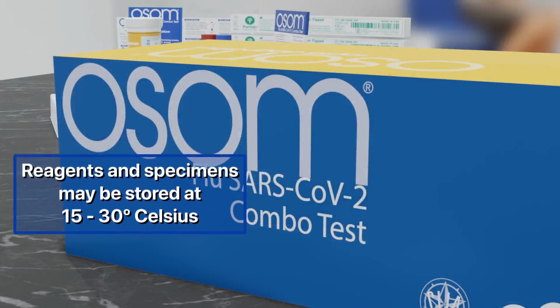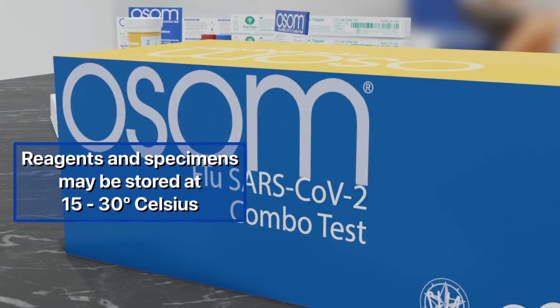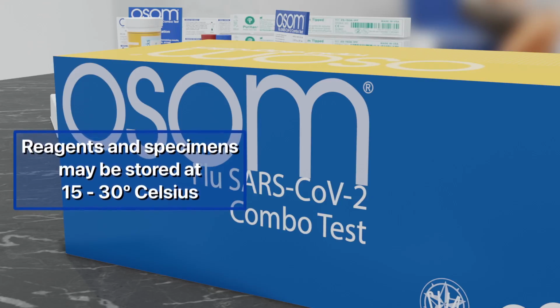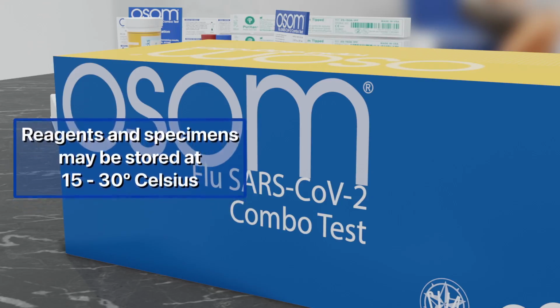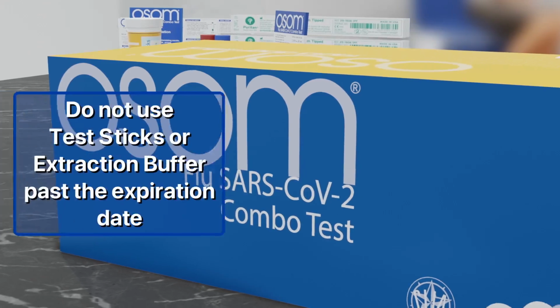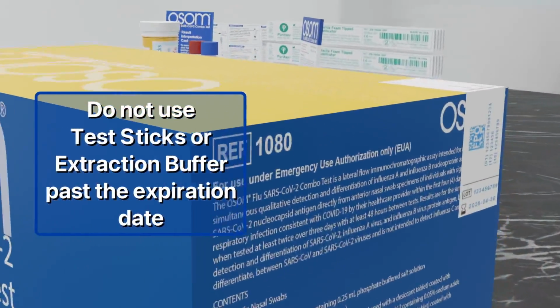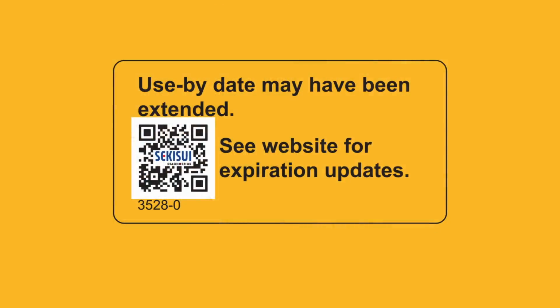Store the OSOM flu SARS-CoV-2 combo test at room temperature, 15 to 30 degrees Celsius, 59 to 86 degrees Fahrenheit, in the original packaging away from direct sunlight. Do not freeze any of the test kit components. Do not use test sticks or extraction buffer vials after the expiration date printed on the outside of the box. Note, the use-by date on your kit may be extended.